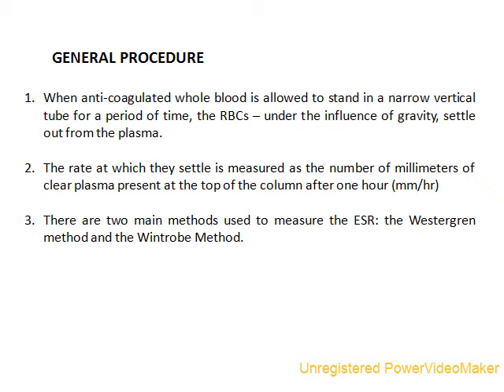There are basically two types of methods that we use to determine ESR. One is the Westergren method and the other is the Wintrobe method. We will be discussing the Westergren and Wintrobe methods in detail, and the differences between these two tests.